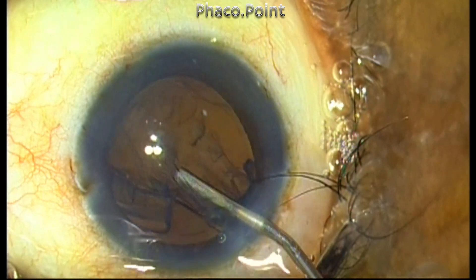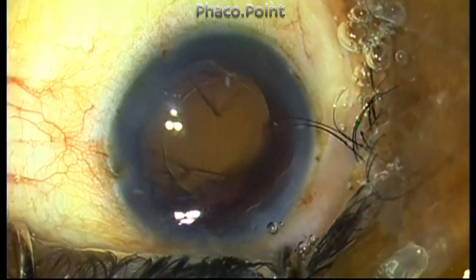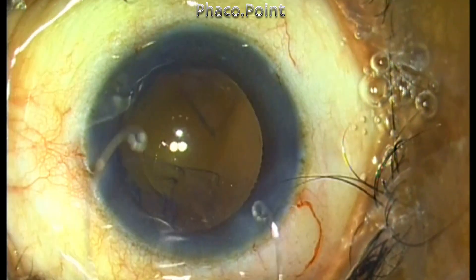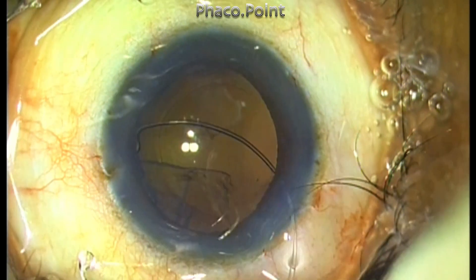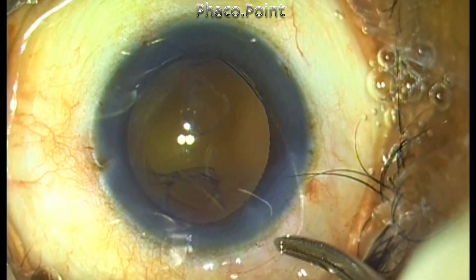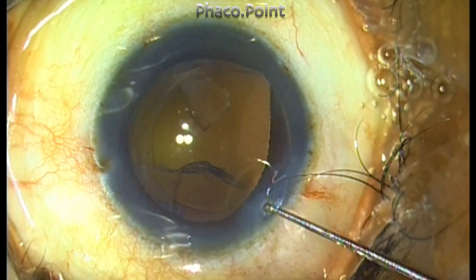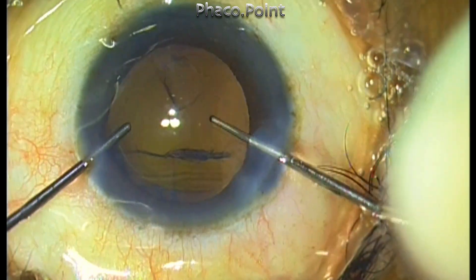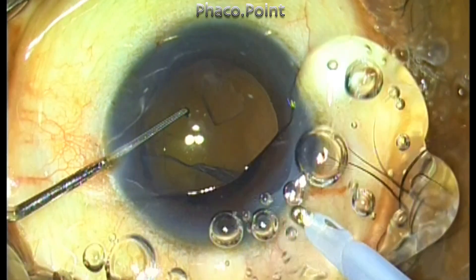The great lifesaver in this situation is the availability of the capsule tension ring. It is threaded into the capsular bag by a hand-over-hand maneuver. The capsule tension ring stretches the equator of the capsular bag and works beautifully when zonular dialysis is less than three clock hours and surrounding zonules are strong. Once in place, removal of the superior cortex can be done without worrying that the capsular bag will follow the phaco tip.